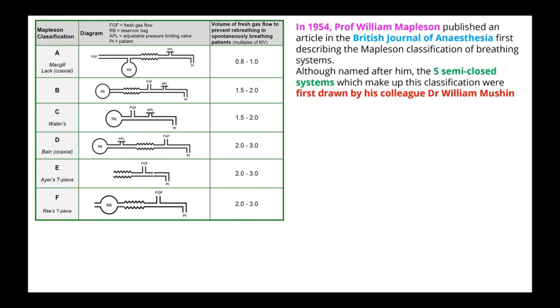Though it is described by Ayre for pediatric use, are you using it for adults in any situation? Adults, maybe very low weight, underweight patients. Are you using it for any adult patient, ISTPs? Anybody else in the class?